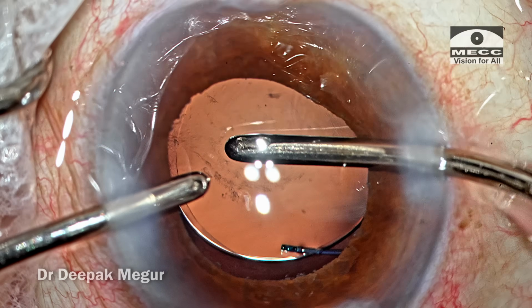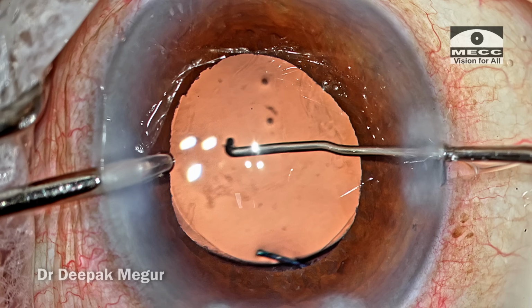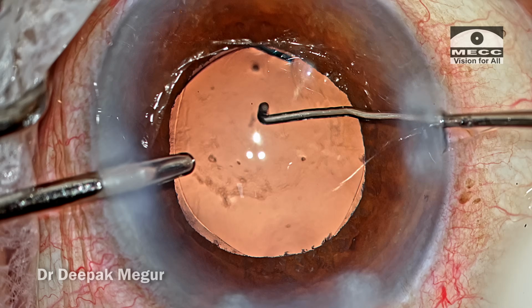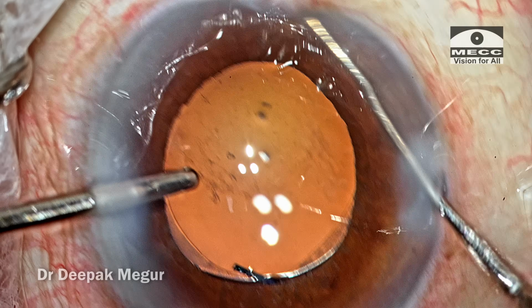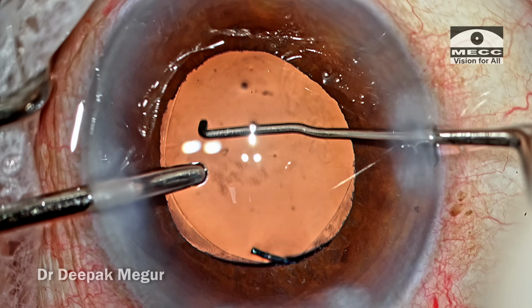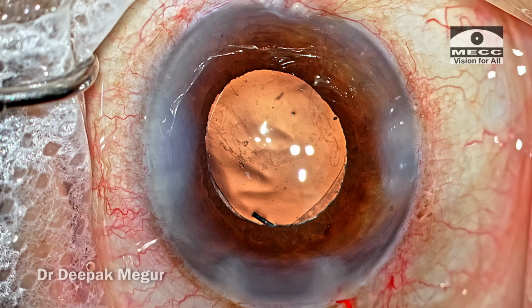Once the OVD is out, time to achieve the optic capture. With my irrigation in my left hand, the optic of the lens is gently tapped posteriorly so that the optic goes into the capsular bag while the haptics are in the sulcus. Ovalization of the rhexis confirms the optic capture, and this is what we are aiming for, and this would ensure a better long-term centration and stability of the lens. The side ports are hydrated. That's it, the case is done.